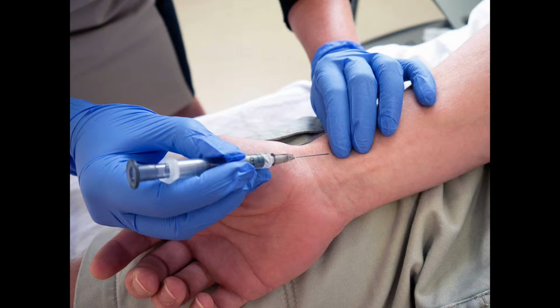You've also got to remember that there are a number of safety considerations for this procedure. There is a high likelihood of exposure to blood. You've got to make sure you're wearing appropriate PPE, discarding soiled items appropriately to clinical waste, and with the use of sharps, you want to make sure that you're using safe handling of sharps at all times and disposing of the sharps into an appropriate sharps container.